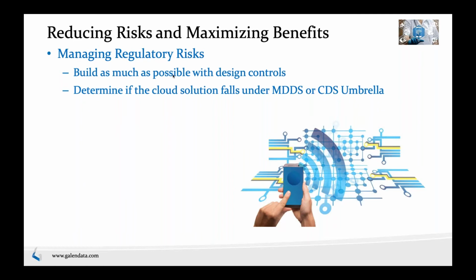There are shortcomings to that as well. For example, on MDDS, you can only make a cloud solution or any solution under MDDS if you don't do any data interpretation. So if you're just taking data in, maybe displaying it as is, raw data, and then transferring the data somewhere else, then that's essentially an MDDS. You have similar restrictions with CDS, but they can be a benefit if you can fall within that zone. They can be very helpful.